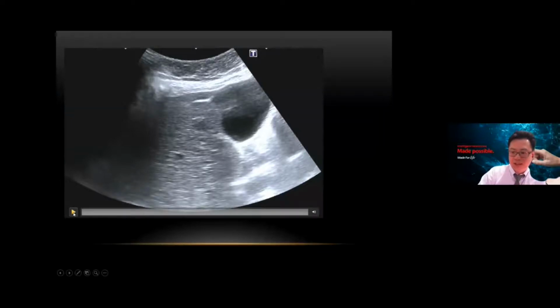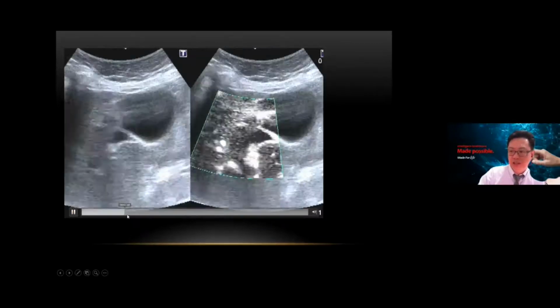So the lesion that we need to focus on is HCC. For small HCC, this is an example case. This is a hypoechoic lesion inside near the gallbladder fossa, which is an area common for focal fat sparing. So we would like to make sure whether this is HCC or focal fat sparing. We have to make sure. I just used SMI to look at it.